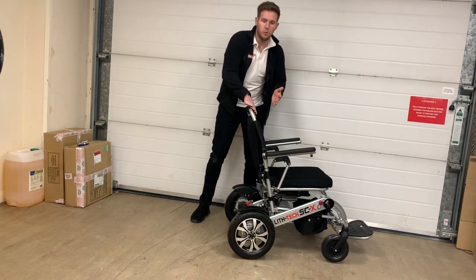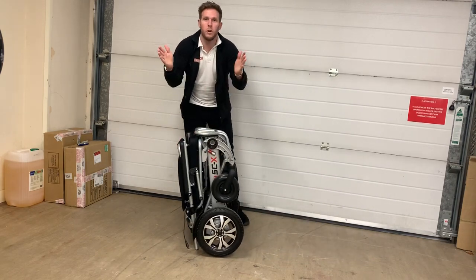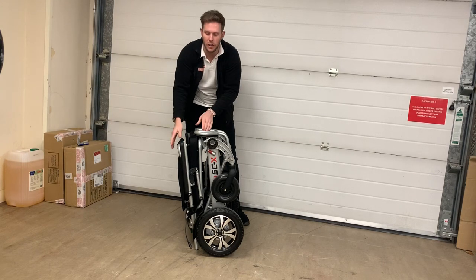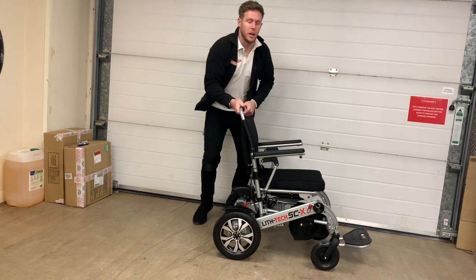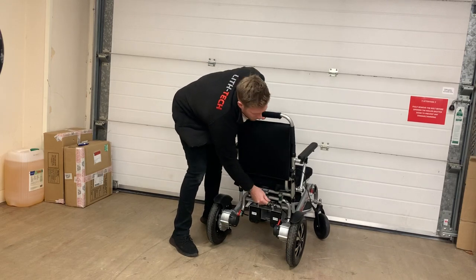To fold the chair, simply push back on the foot plate and bring your hands together. One motion is pushing your hands apart and one motion is bringing your hands together. Once you get more familiar with the chair, you can simply flick it out, let gravity do its thing, and there's a catch at the back which you lock off — and that means you're good to go and nice and safe.